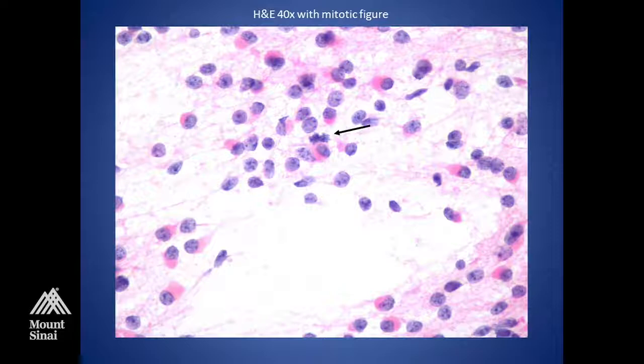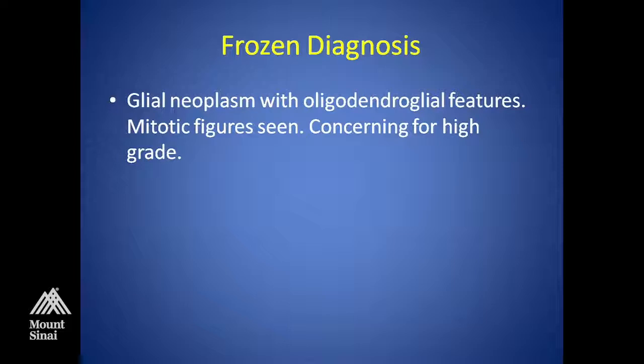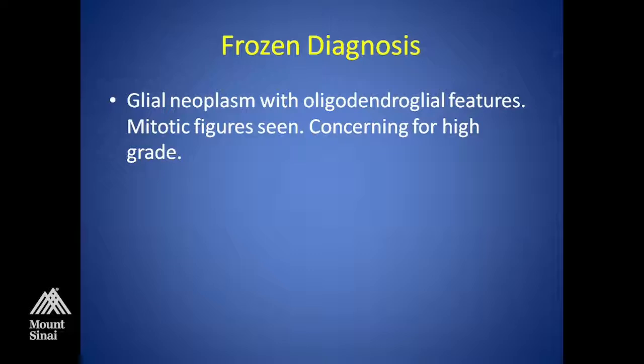The mitotic figures automatically raise concern that you might be dealing with a higher-grade tumor. The frozen section is not very helpful except for telling you it's a very cellular tumor. On frozen, I called this a glial neoplasm with oligodendroglial features — though all you have to say is that it's glial. Sometimes it looks oligodendroglial because of round nuclei and open chromatin, but you can be wrong. With molecular phenotype — IDH and ATRX — you'll be able to tell. You don't make the diagnosis of an oligo unless you have 1p19q FISH.